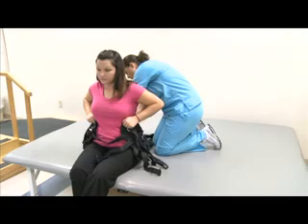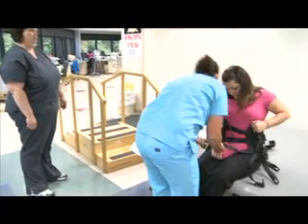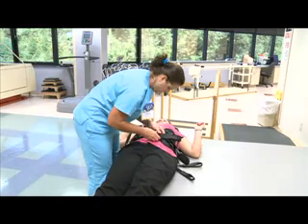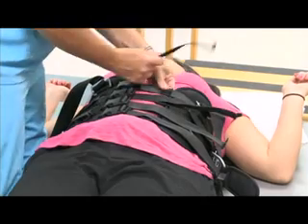And the first step is to get the measurements. We measure the length of the leg, then the length of the bottom part of the leg, and the top part of the leg. We will measure the circumference of their thigh, their calf, and their ankle so that we can get all the right body parts onto the machine so that it would fit their body accurately.